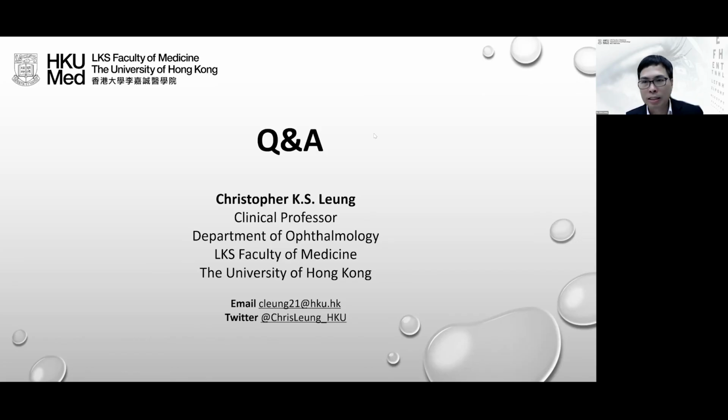But unfortunately, we don't yet have these figures for OCT. In fact, the OCT measurement of RNFL thickness, the number itself, cannot be used interchangeably between different models of OCT. So it's actually pretty hard to get a threshold, and so we don't have that.